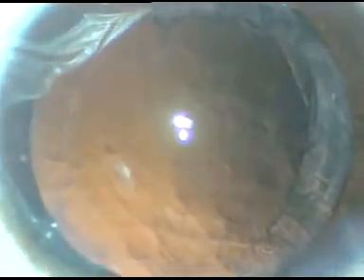The rest of the nucleus is worked on. This is a soft cataract, and in no time the nucleus was managed. Now, a little bit of cortical lens matter remains. I am injecting a little bit of viscoelastic substance, and I am going to remove this cortical matter with a Simcoe cannula.